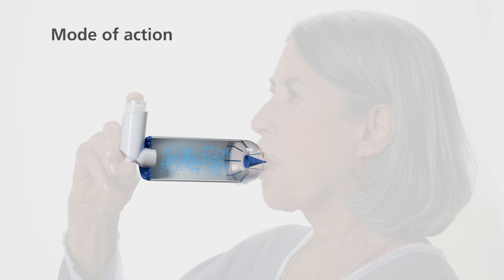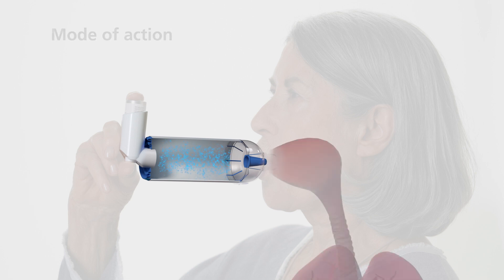The medication is sprayed into the holding chamber where it disperses evenly and can be inhaled in one or more breaths. This means it's not necessary to trigger and inhale at exactly the same time. It also prevents too much medication lingering in your mouth and throat.